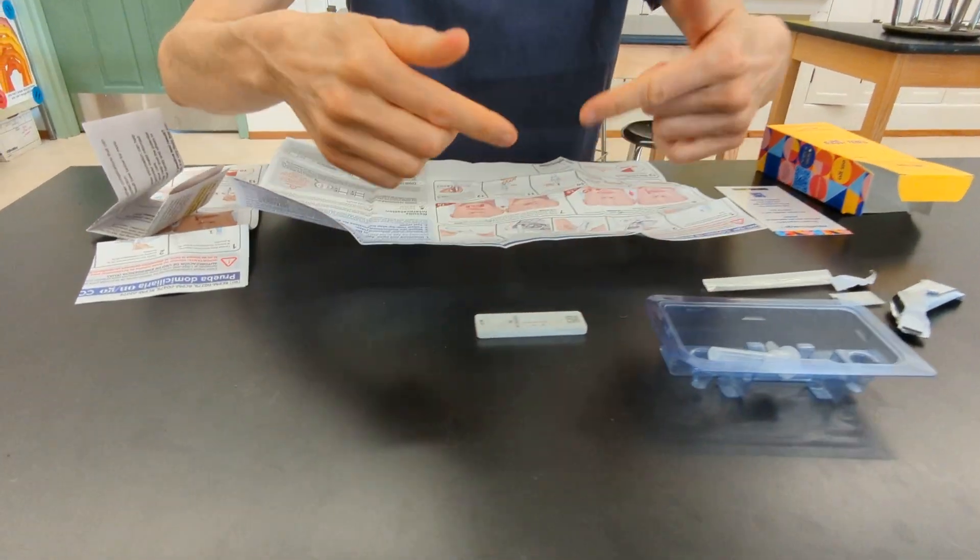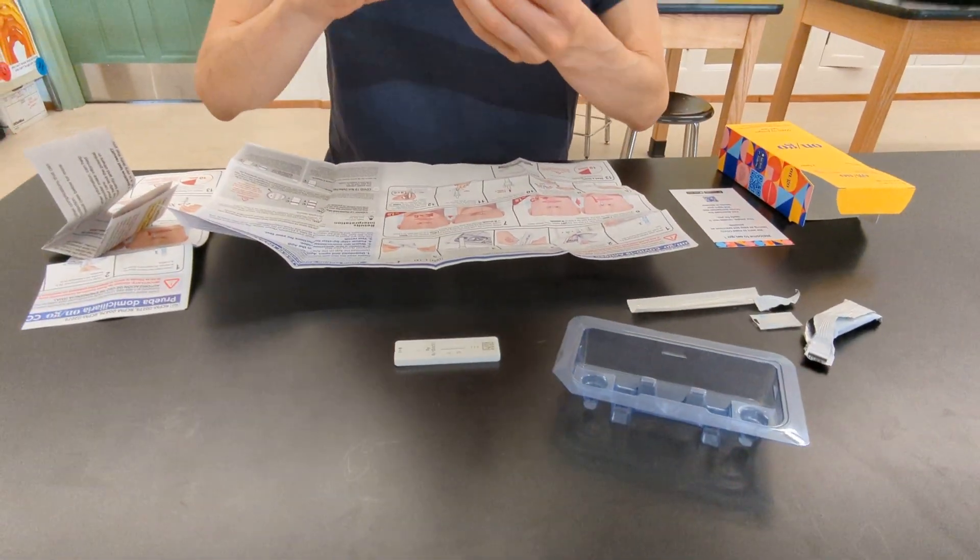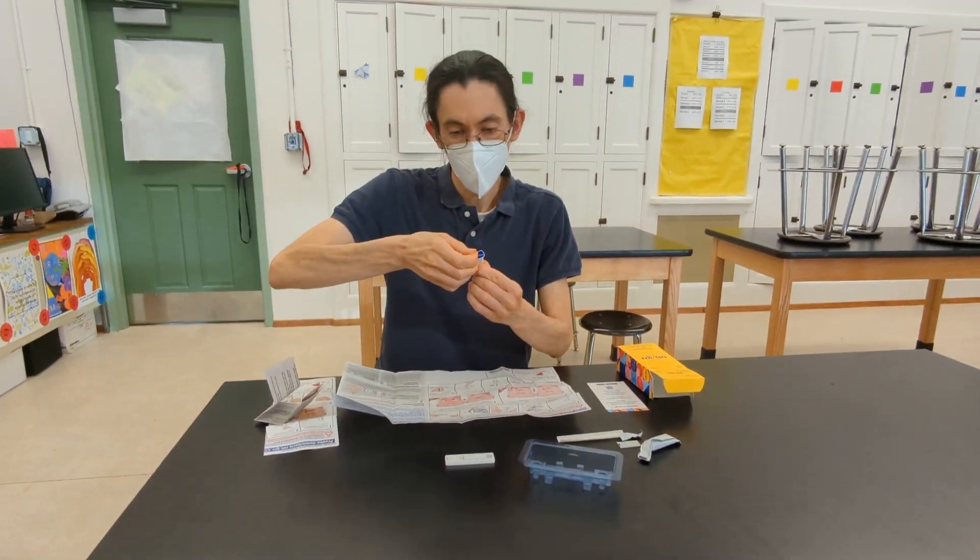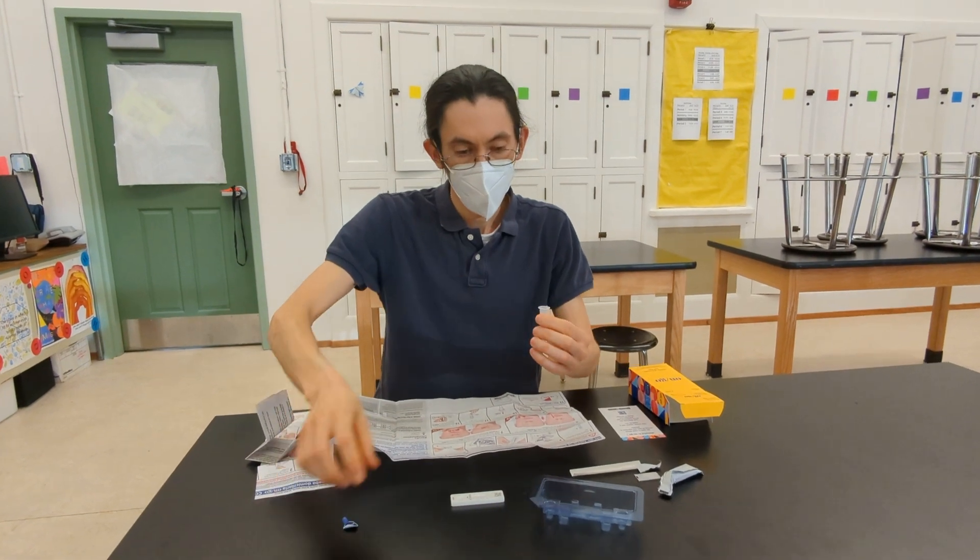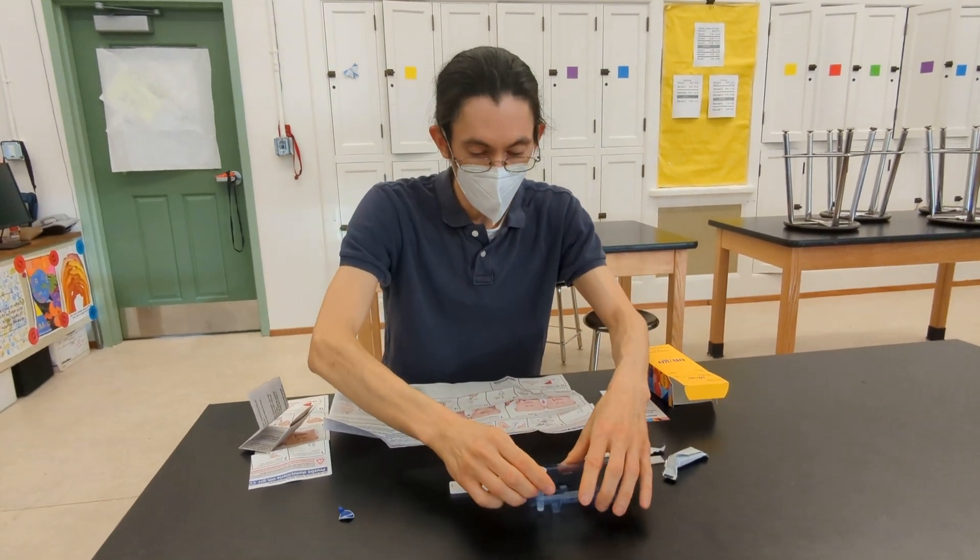It helps to orient the materials just like they have in the instructions. The next step is to peel off the lid of the extraction vial and place it in your container.